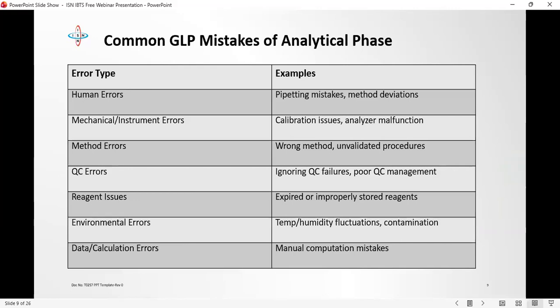You may even see situations where some assays pass quality control while others fail, and that often confuses people. They will say, I ran quality control on all of my parameters for the day. Why is it that some are passing and others are failing? This is parameter specific. Different parameters behave differently.